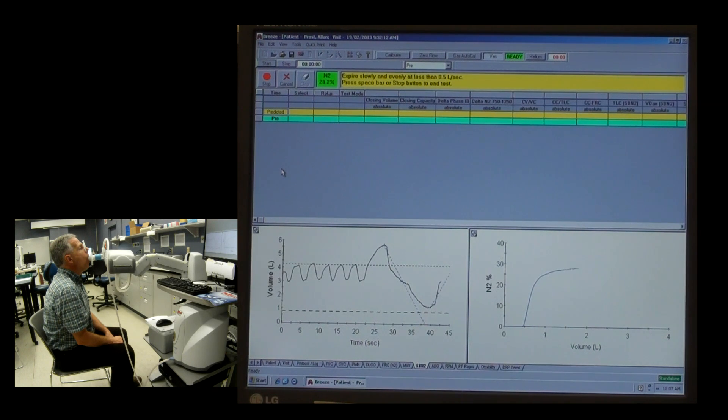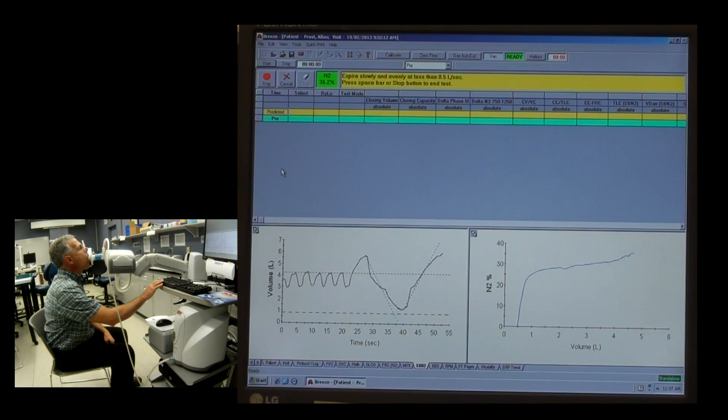And then exhale up against the other sloping line — just a nice, easy exhalation. Keep going, nice exhalation all the way out as much as you possibly can. And there we go — that's end of test.